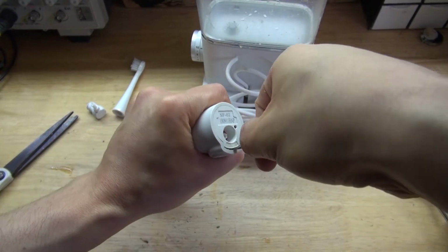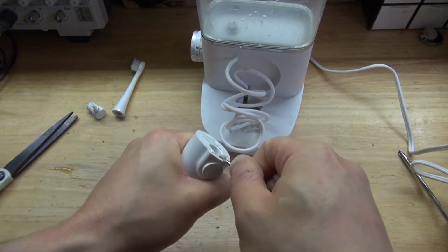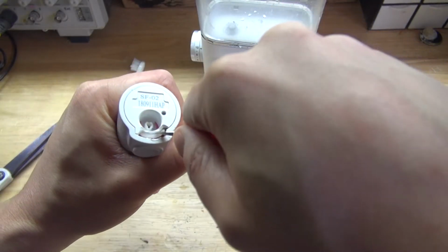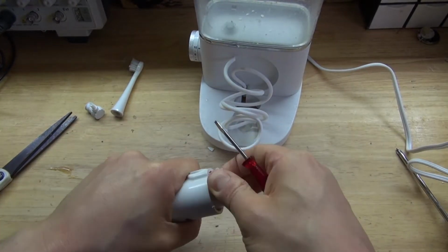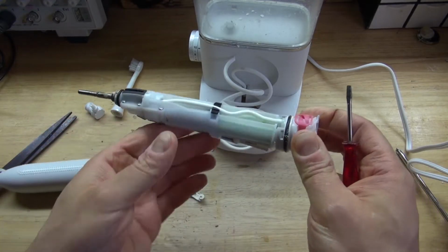And as you can see, there are no obvious screws, so what I need to do is take this flathead screwdriver and just simply pry it open. Kind of breaks apart a little bit, so I need to keep digging a little deeper. Working it, and there, it comes out just like this. Interesting.